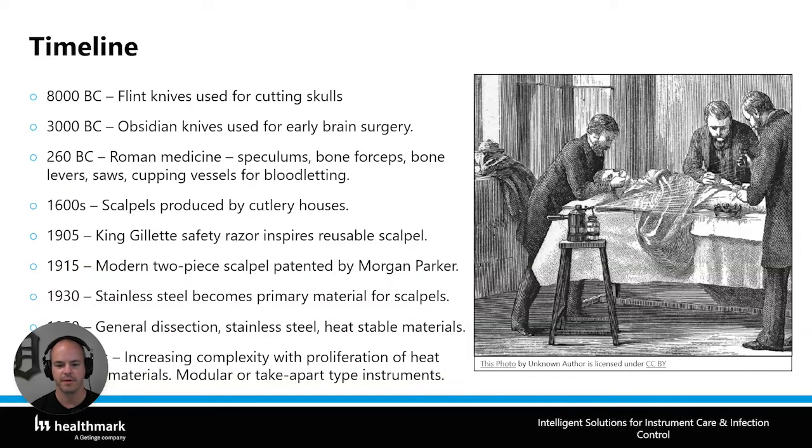And then from the 1960s, 70s, and 80s, you start to see an increasing proliferation of instruments and complexity of the instruments. Heat sensitive materials come out, modular or take-apart instruments come out.